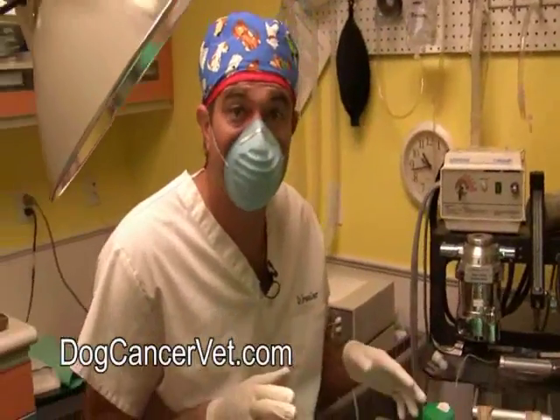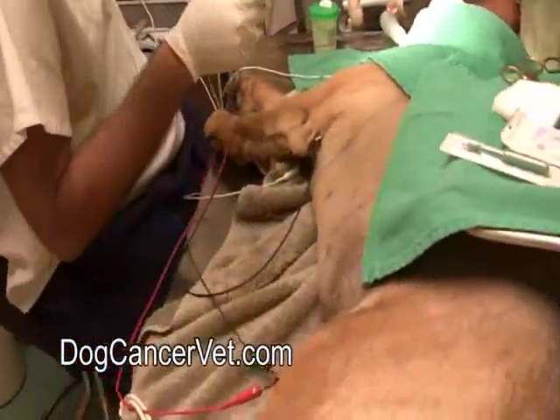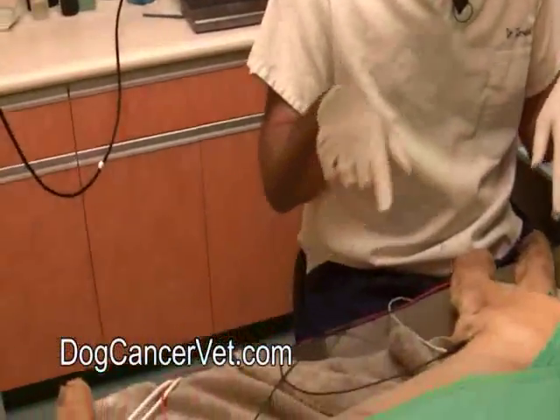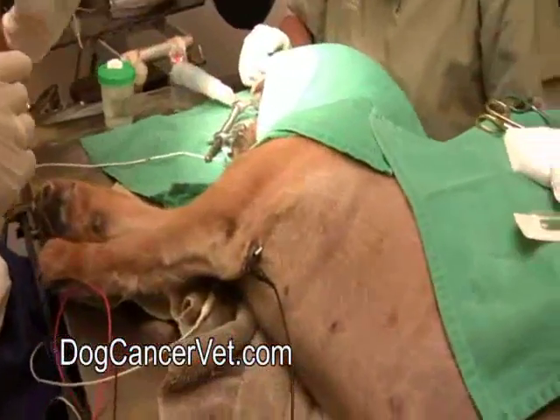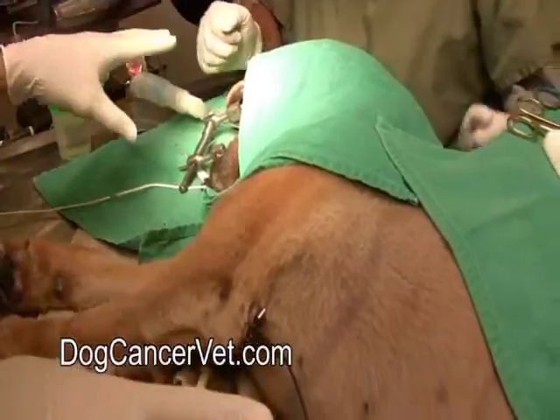Okay, so here we're with Bjorn, and he's been anesthetized. He's all hooked up to his monitors. We're keeping track. You can see over here we've got his heart, the ECG trace going. We've got his blood pressure, which we measure to make sure it doesn't get too low. There's his cuff. I've got another little clip right here on his tongue that measures how much oxygen saturation is in his blood. So we're making sure that everything is nice and safe.